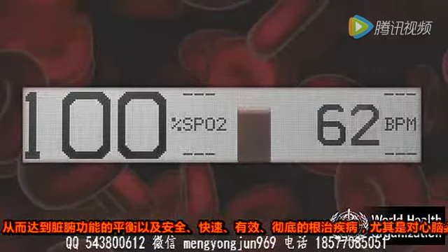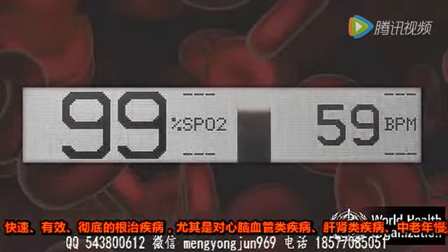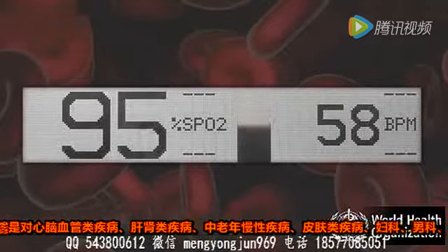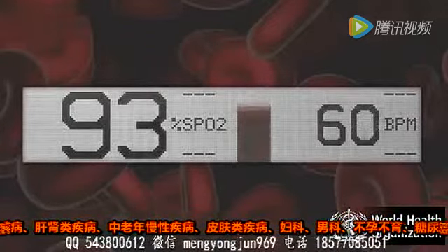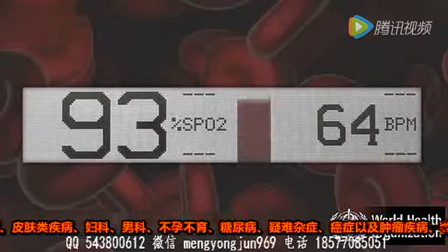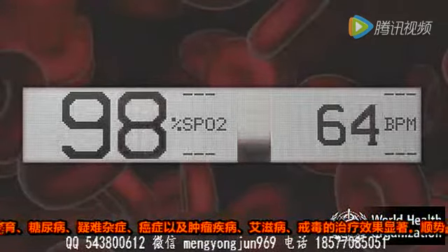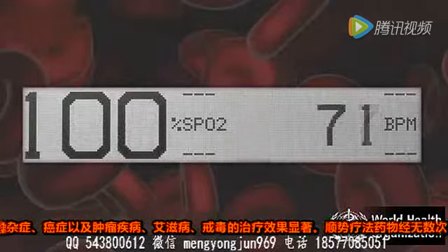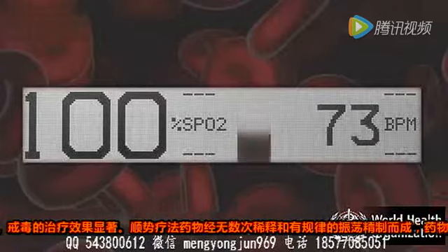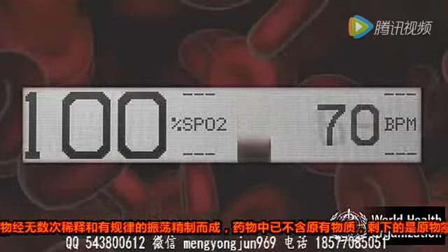The pitch drops as the saturation falls and rises as it recovers. This allows you to hear changes in the oxygen saturation immediately, reducing the need to refer to the monitor.